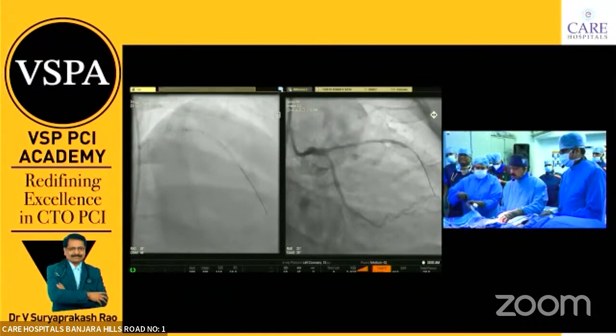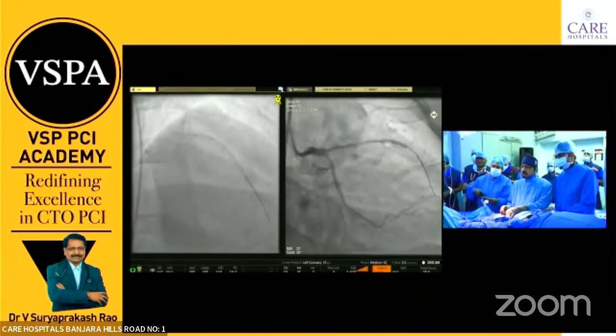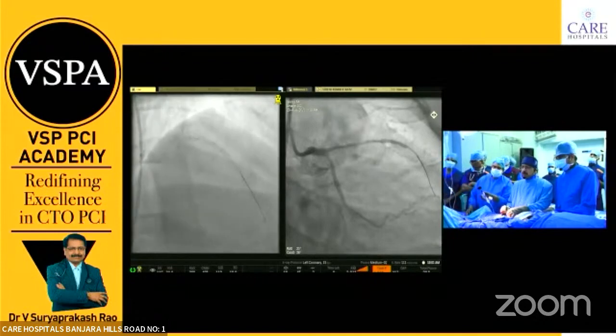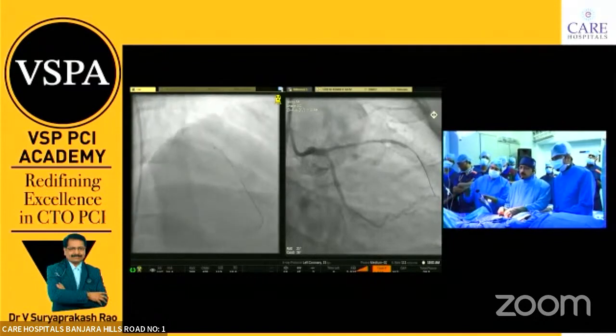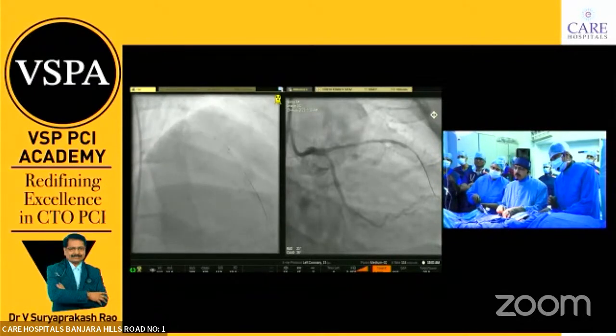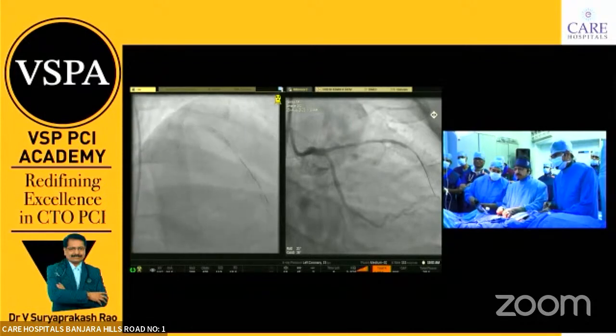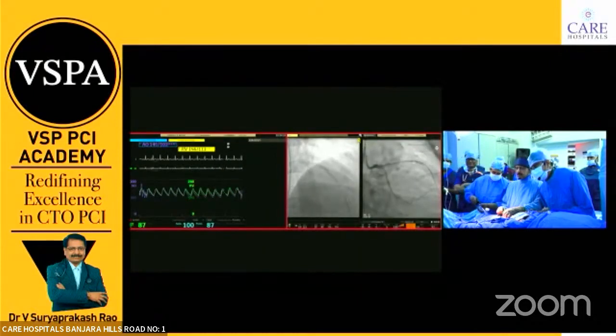Balloons. I will go down. Lower left. This balloon profile is gone. 12, 14. 14.